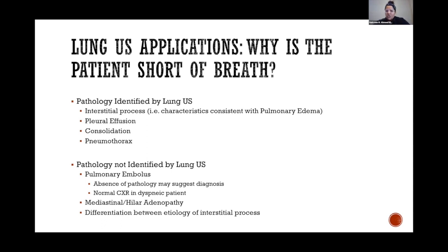The pathologies that we can identify are interstitial processes, for instance things like pulmonary edema and interstitial lung disease. Pleural effusions can be identified, as can consolidation, such as what you would see with pneumonia, and pneumothorax.